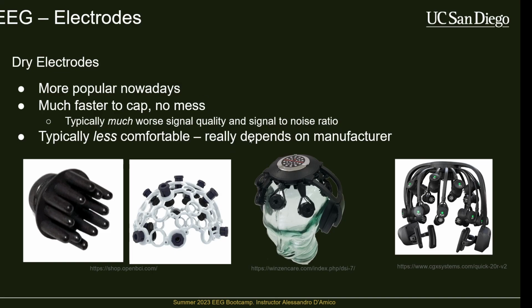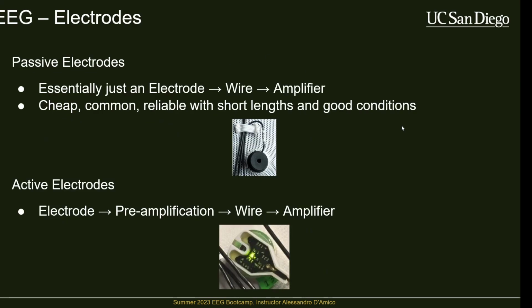But there's not that much evidence showing that dry electrodes are suitable for high quality research grade collecting. Some systems have been validated for sure, but you can't ubiquitously say that all dry electrodes are sufficient for collecting research grade EEG. So they're not fully adopted yet.